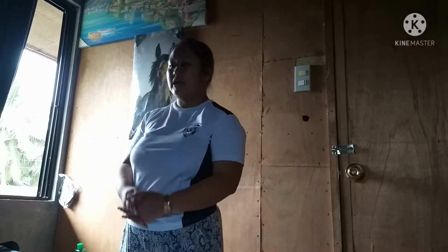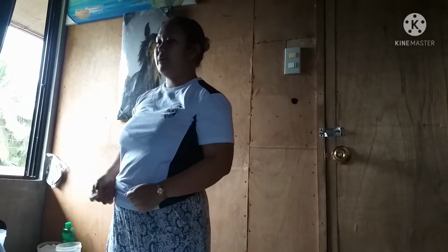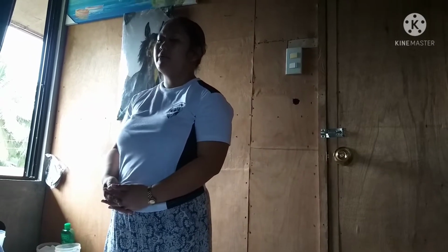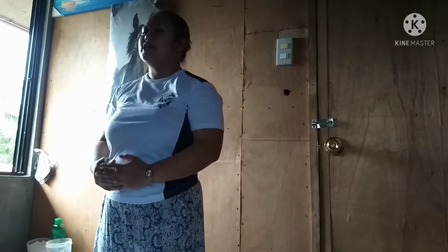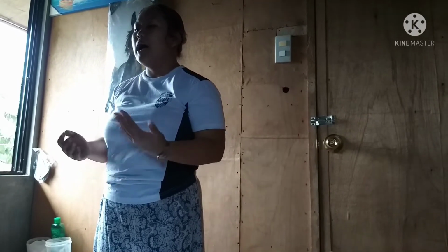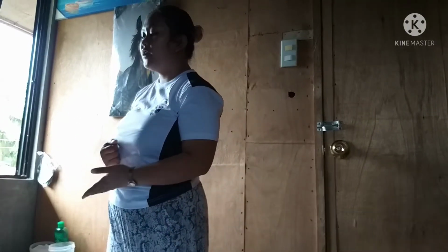Next is blood pressure. These are the following equipment: stethoscope, sphygmomanometer with appropriate size of cuff, jot-down notebook and pen, alcohol swab. Procedure. Explain the procedure to the patient. Make sure that the client has not smoked cigarettes or ingested beverages that contain caffeine within 30 minutes.